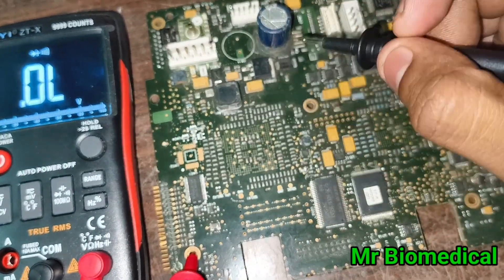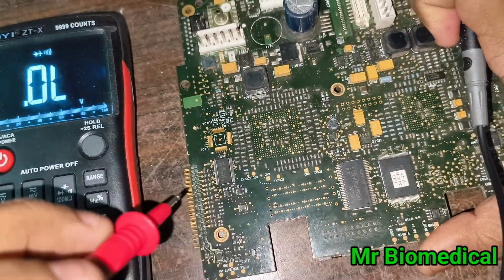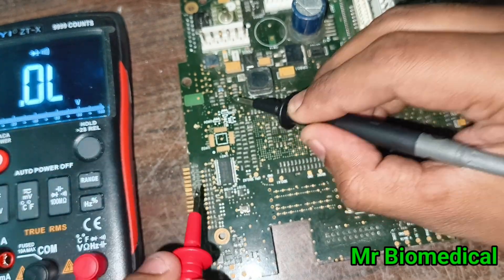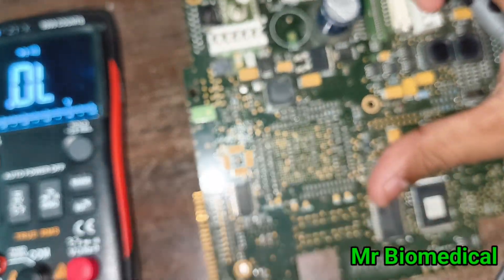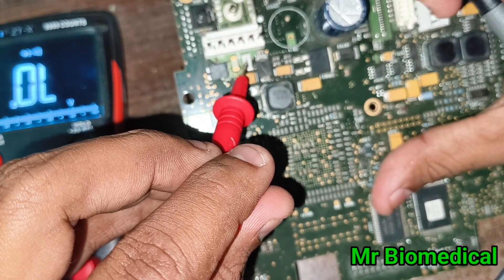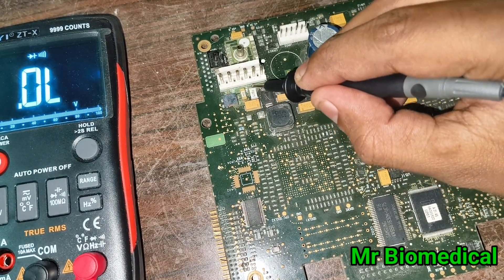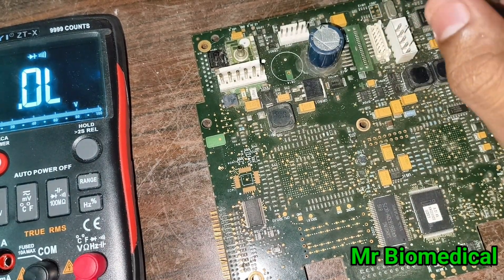Here you can see a zero ohm resistor. It works just like a fuse — it gives you a buzzer sound. These are the fuses. You need to know the difference: resistors and fuses look different. They will mark fuses as 'FB'. You can see 'FB' here, and this one is a resistor.